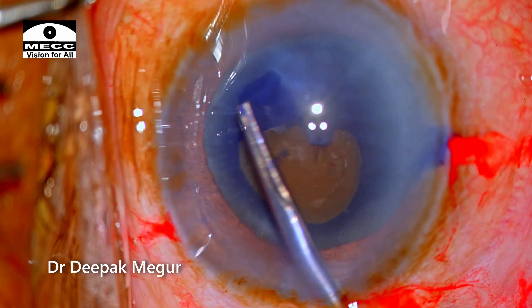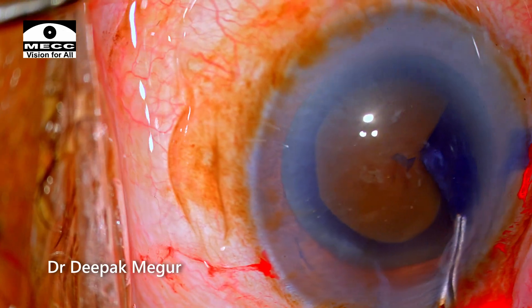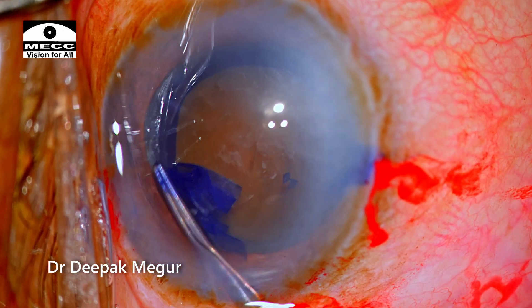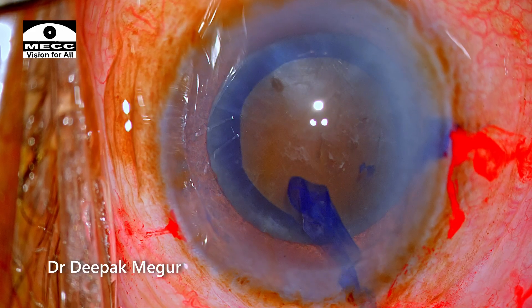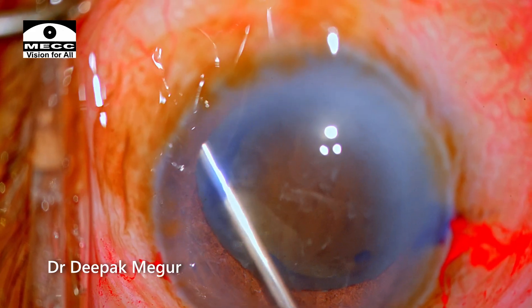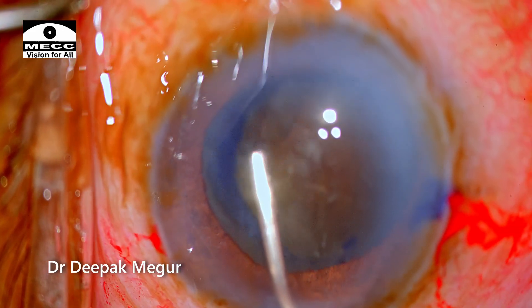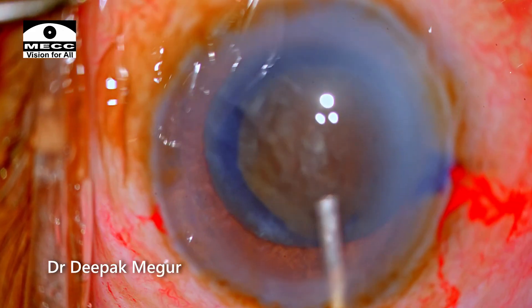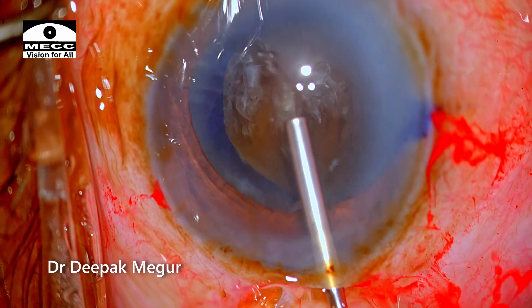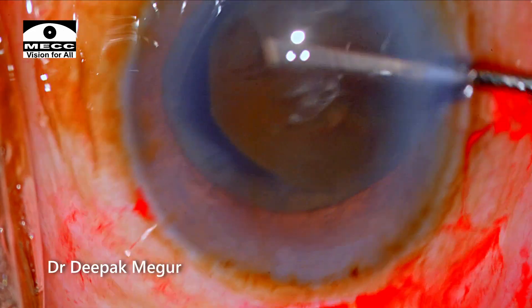A bigger rhexis is critical with such a large, dense nucleus — in this case it is slightly smaller than what I would have actually liked. I am performing gentle hydrodissection with very minimal fluid. The lens is extremely bulky and occupies the entire lens capsule, so using a large amount of fluid can bloat the posterior capsule. Use very small amounts of fluid at multiple quadrants. Nucleus rotation confirms a free nucleus from its attachments.